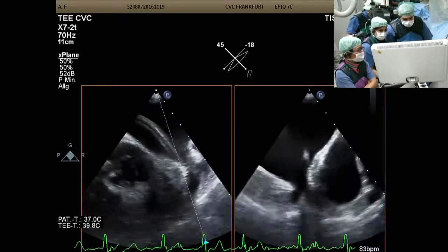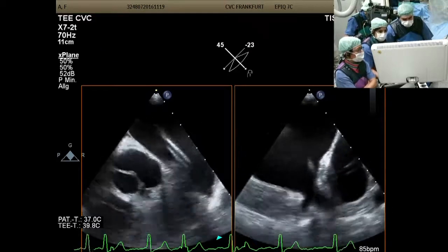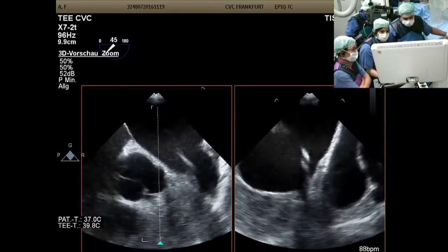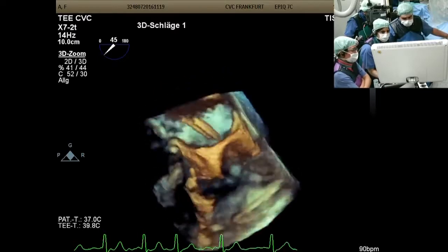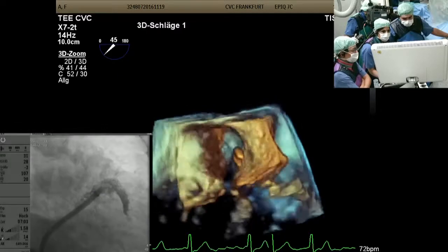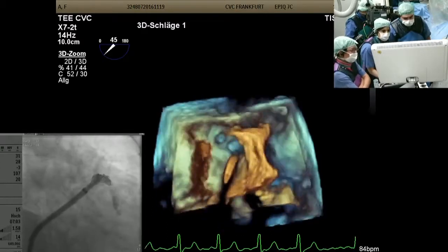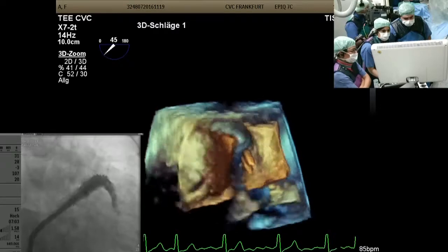Anyway, angiographically it looks inferior, but the advantage of the Amulet is that you can form the ball and then counterclockwise it up to the anterior, which probably has a bit more space. Yeah, my guess is that it is in the inferior, or heading towards the inferior. That's what we saw angiographically. Oh no, the sheath now is definitely in the superior. Yeah, we can't even sort out whether it's anterior, superior, or inferior at the moment.